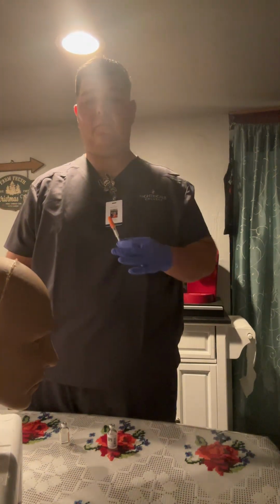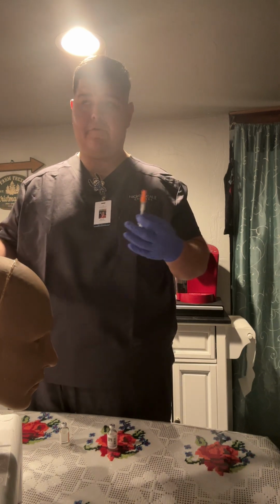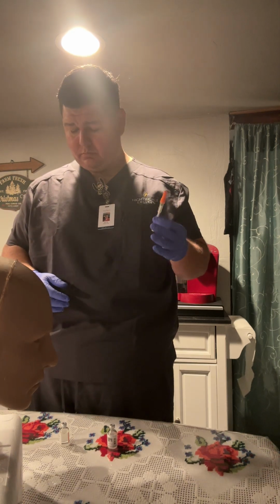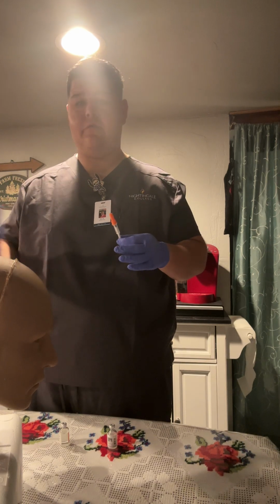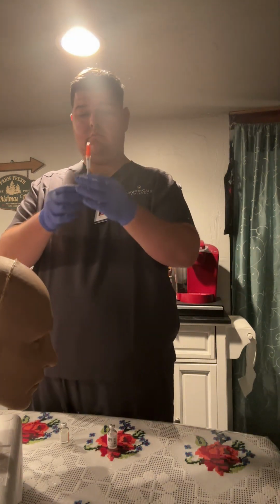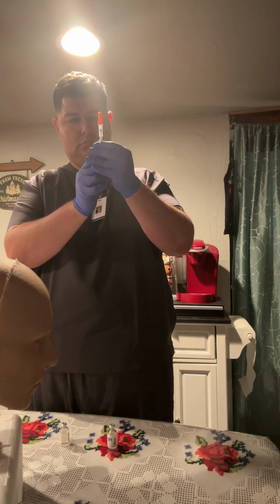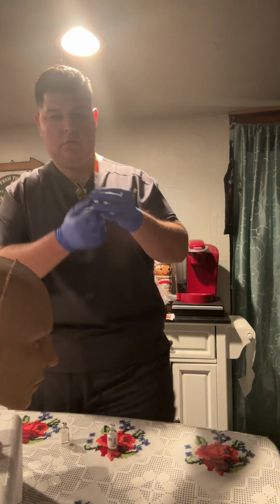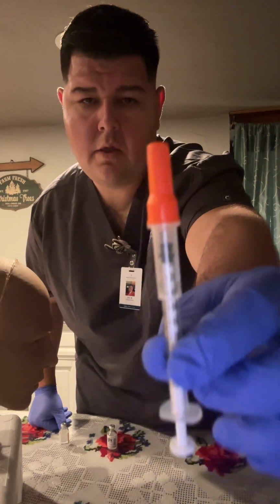So for this first one, I will be drawing up 8 units of intermediate insulin. The nurse and I will verify the process and the orders with the MAR. Okay, so I have 8 units of air that the nurse and I will verify against the MAR. So let me draw my 8 units of air. We'll show that to the camera. Very hard to see here.